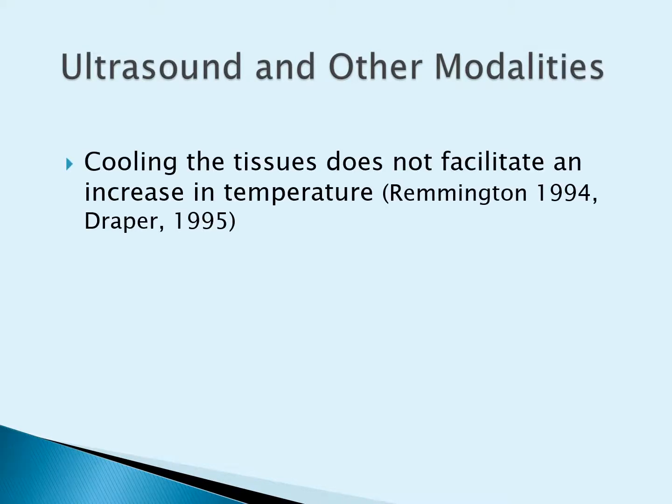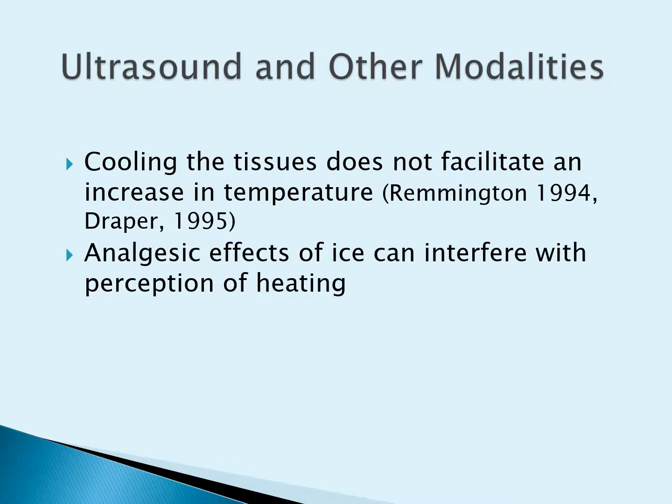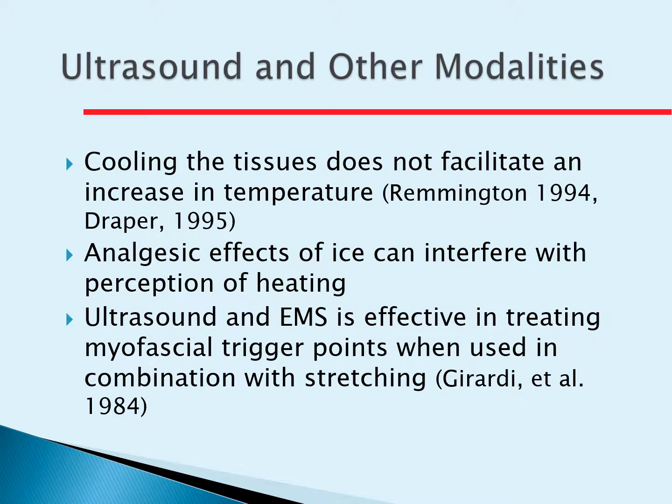Other modalities: cooling tissue does not facilitate an increase in temperature, which makes sense. You don't typically want to use cooling right after ultrasound, because you would interfere with the actual perception of heating at that point. Ultrasound and EMS is useful for treating myofascial trigger points. Ultrasound with electrical stim is very useful.